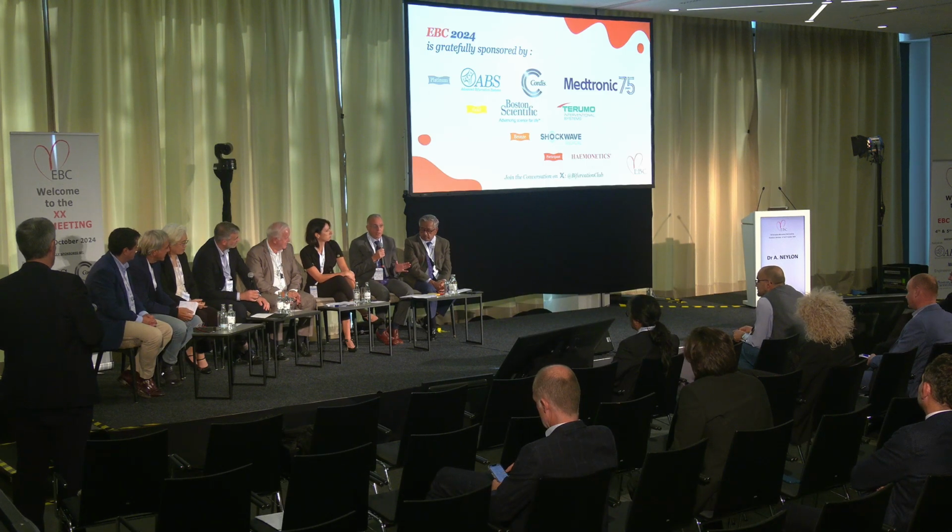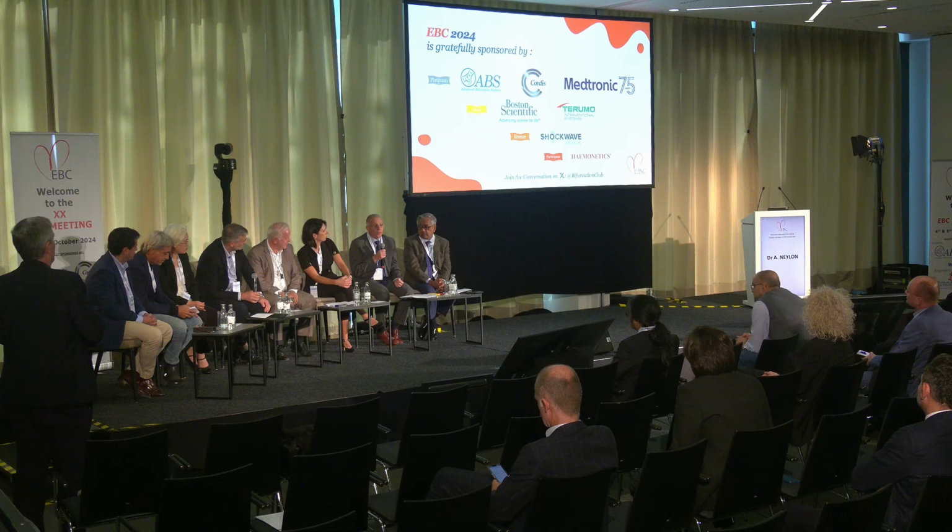incorporating trials in our practice, probably this is why we are talking here, is to understand the flow that generated the data. So this is not a study that is against side branch intervention systematically. It is against side branch intervention in the absence of many things. Honestly, what I was quite surprised to see were side branches that are 2 millimeters. Yeah. This is probably the most important thing, because side branches were 2 millimeters with good flow, POT performed.